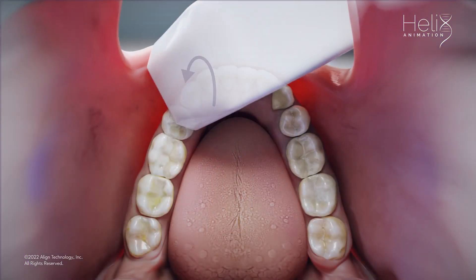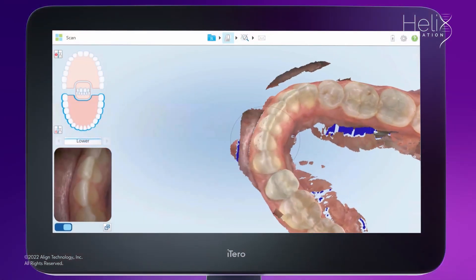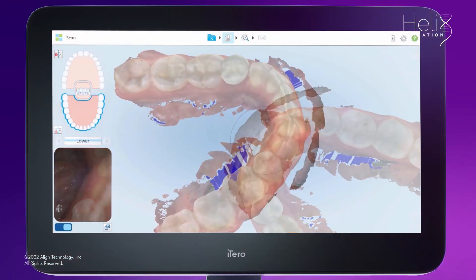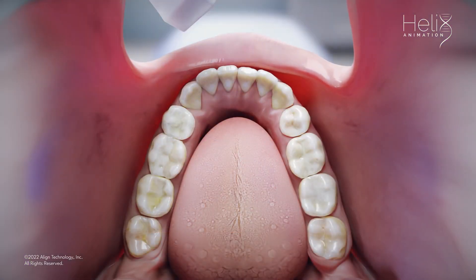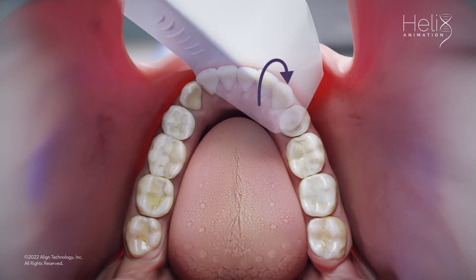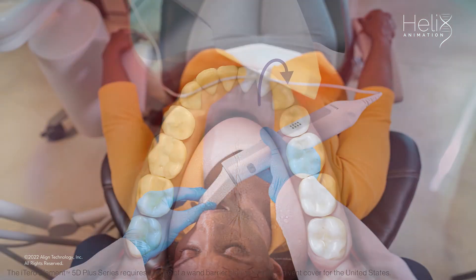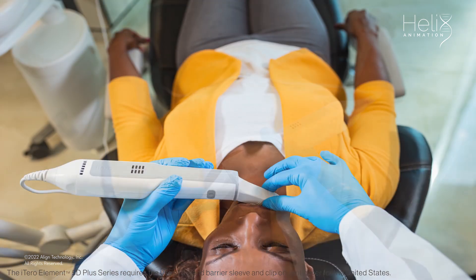Next, capture solid anterior incisal anatomy by placing the wand so that the cuspid and the lateral are centered in the viewfinder, and then roll from the lingual surface over the incisal edge to the facial. Repeat this step on the contralateral side. These images show how to position the sleeve on the incisal edge to roll and capture the anatomy. Retract the lip to leave room for the sleeve to move.